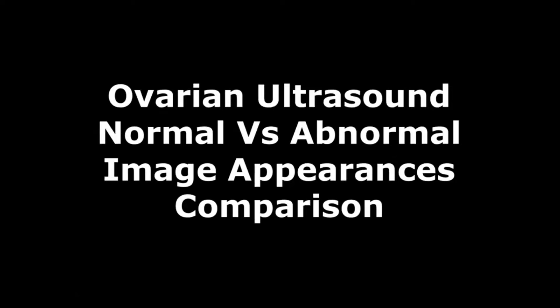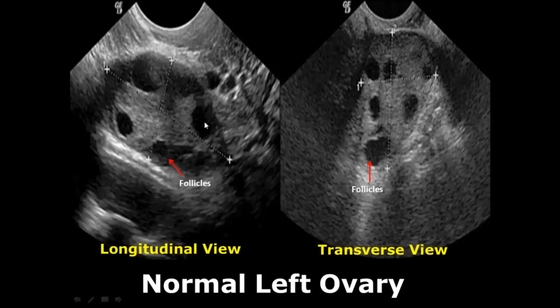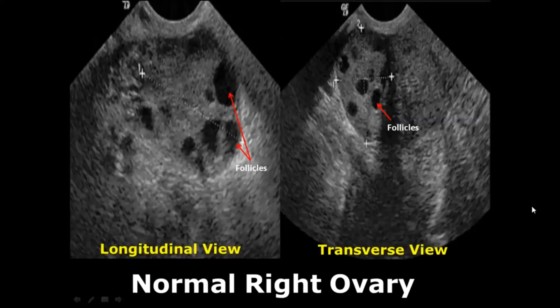Hello everyone, this is Dr. Sam and today we will talk about ovarian pathologies on ultrasound, comparing the normal and abnormal appearances of ovaries. Starting with normal views of the left ovary: in the longitudinal view it is wider with multiple follicles, and in the transverse view it is taller. Similarly, both longitudinal and transverse views of the right ovary show follicles visualized.